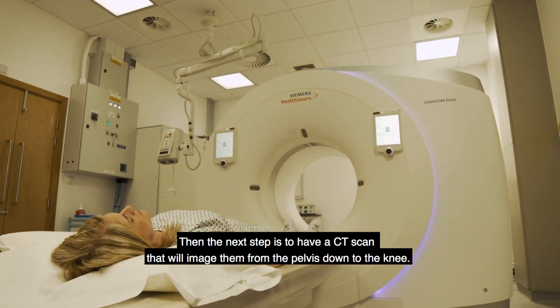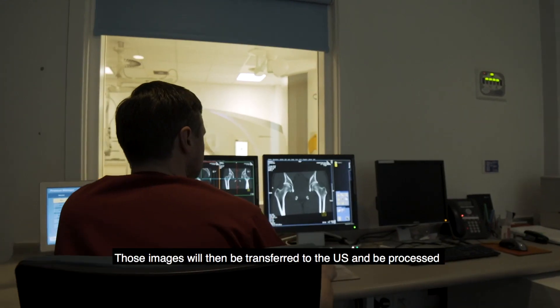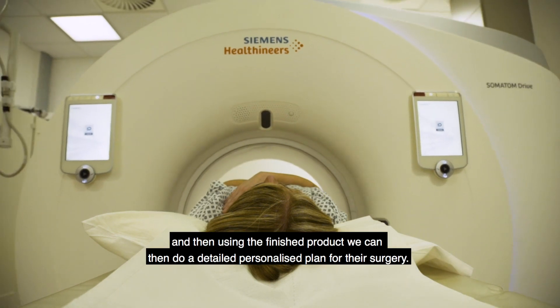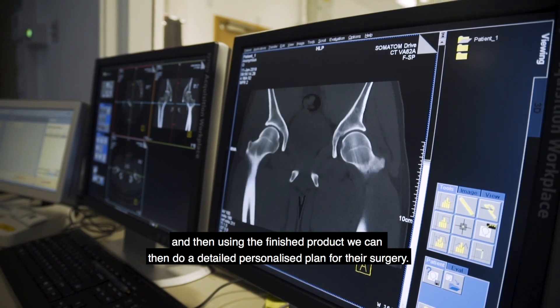The next step is to have a CT scan that will image them from the pelvis down to the knee. Those images will then be transferred to the US to be processed, and then using the finished product we can do a detailed personalized plan for their surgery.